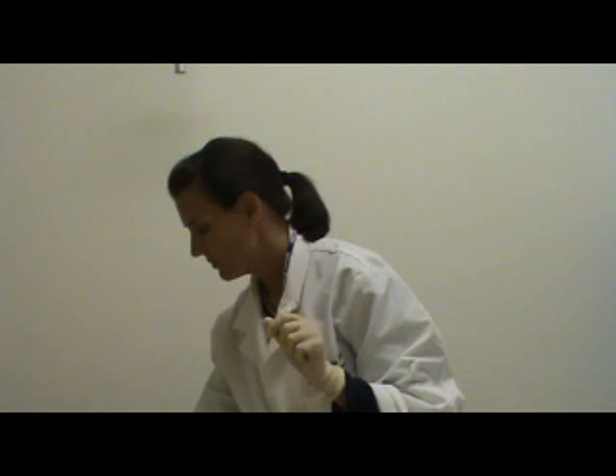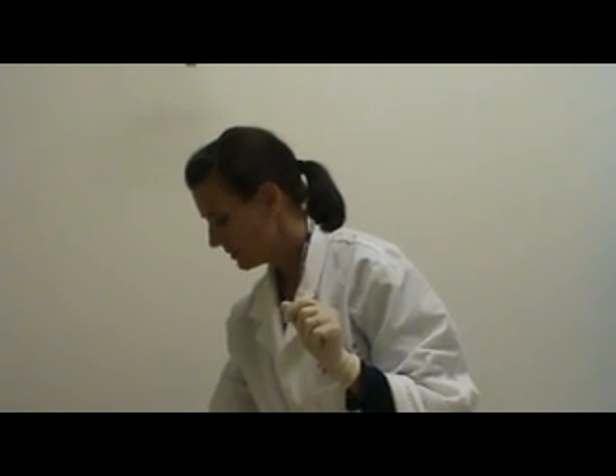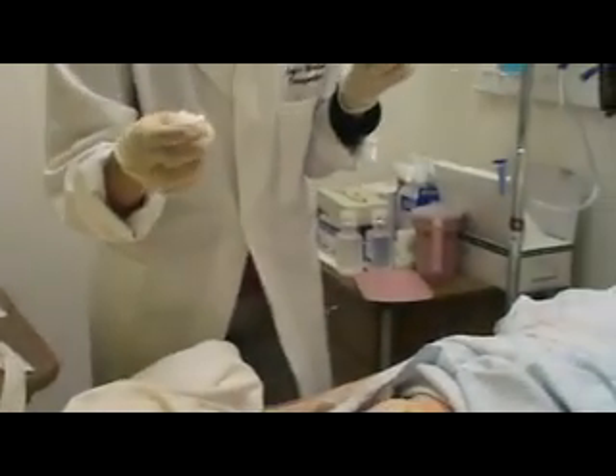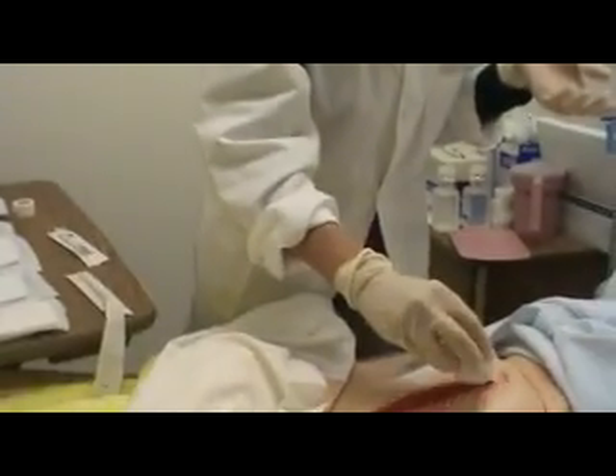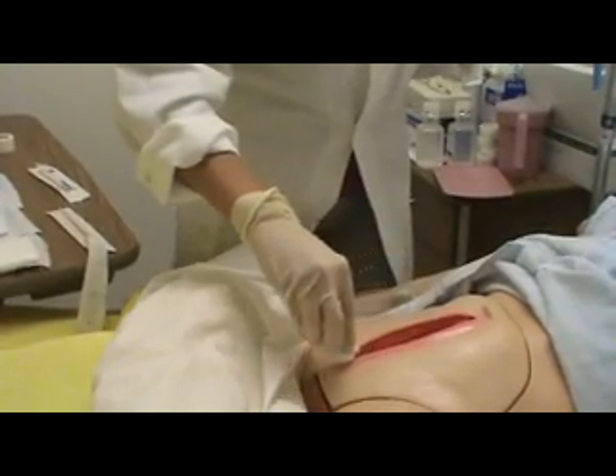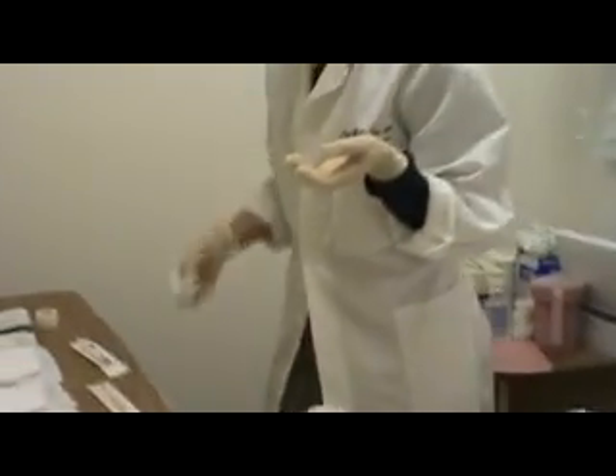Now I am going to clean the wound bed, so I am going to use my first package of 4x4s. It's not too wet, and I am going to wipe from the area of least contamination to most contamination — so I am going to go from the belly button down with one swipe, and then I am going to dispose of that.